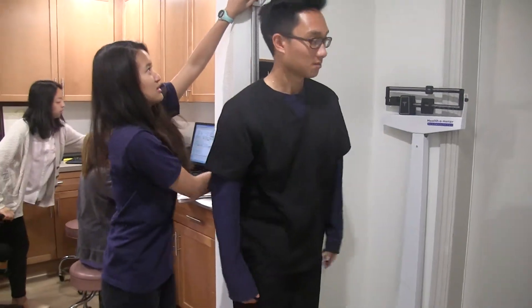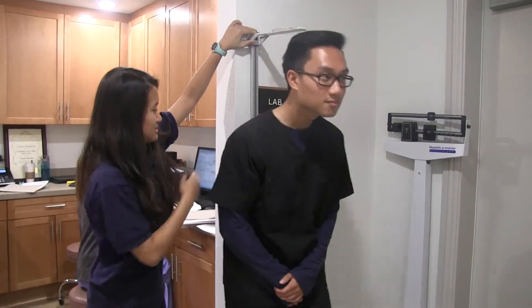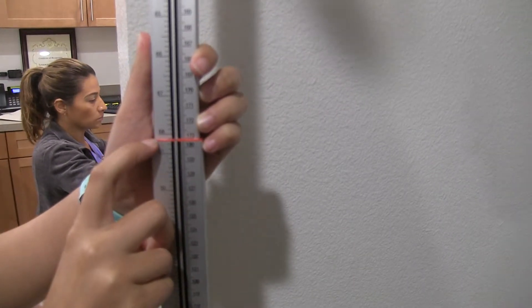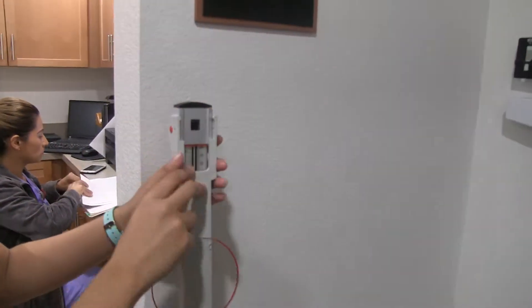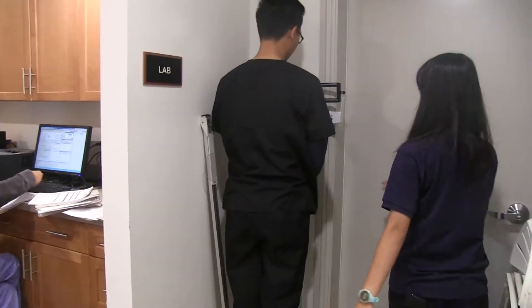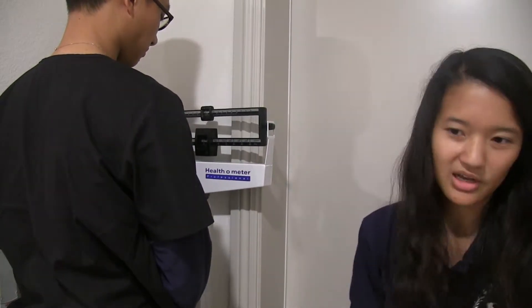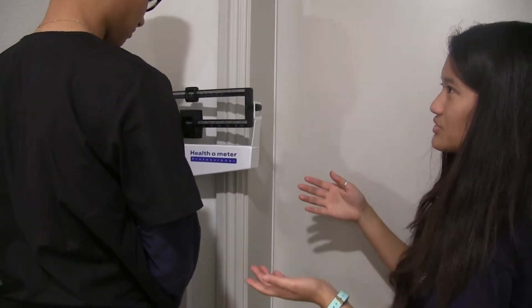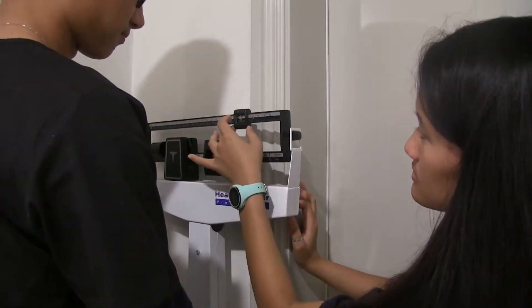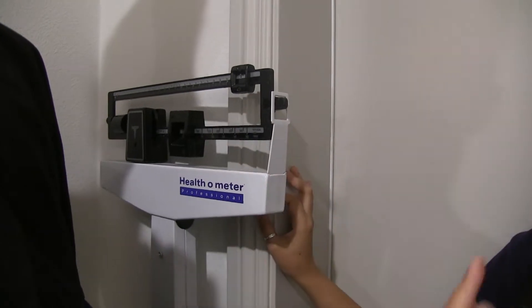You lean the ruler up against the wall and ask the patient to stand back, then look at the number. On the left side it's shown in inches and the right side is in centimeters — so 68 inches. For the weight, we ask them to step on the scale. We're aiming for the balance to level out. I look at his regular weight and go from there. The bottom reads 100 pounds and the top reads 48, so you add them together — that's 148 pounds.